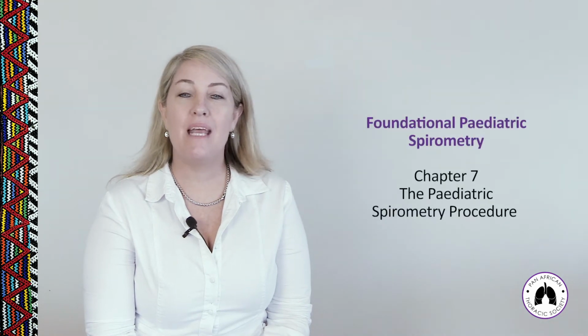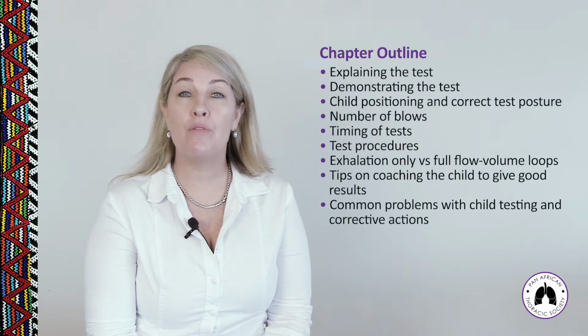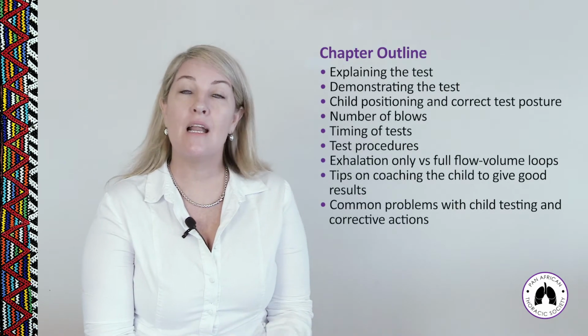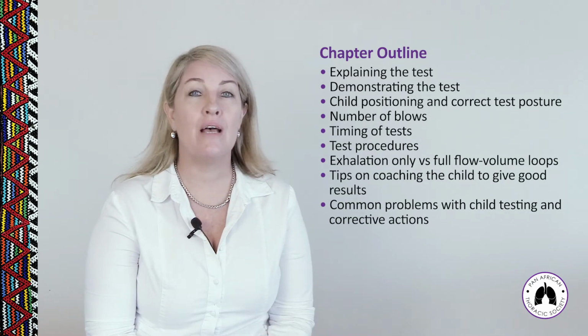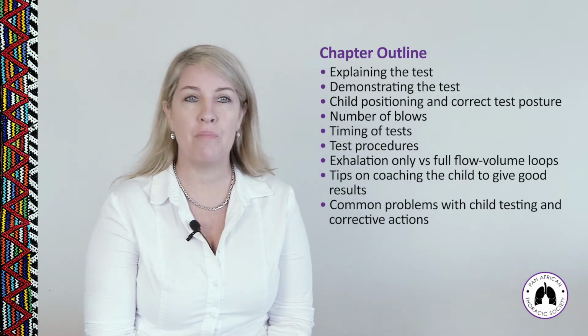Chapter 7, the Pediatric Spirometry Procedure. So in Chapter 7, I'm going to run through how to conduct the procedure. Now, most of this will be done through practical demonstration, but it's also nice for you to have a little bit of theory on it as well to refer back to.